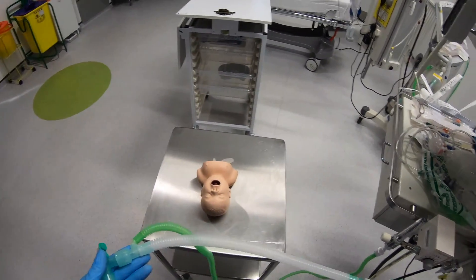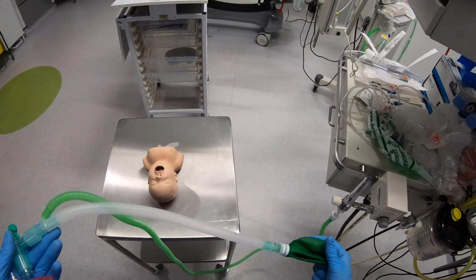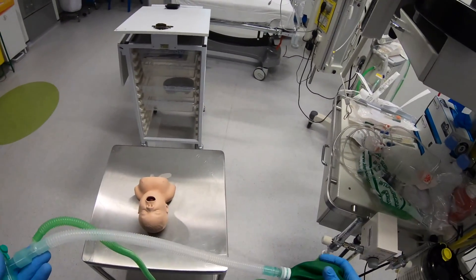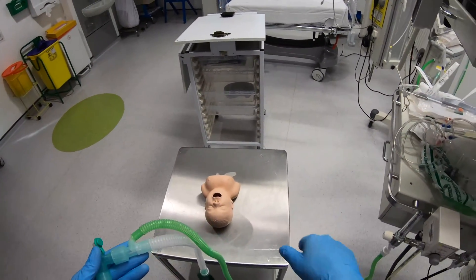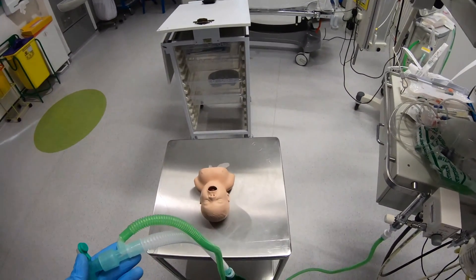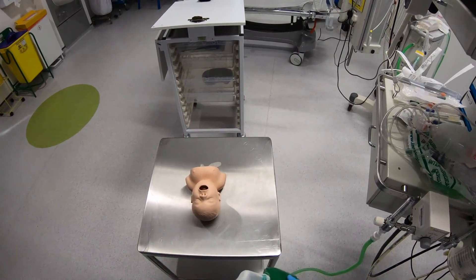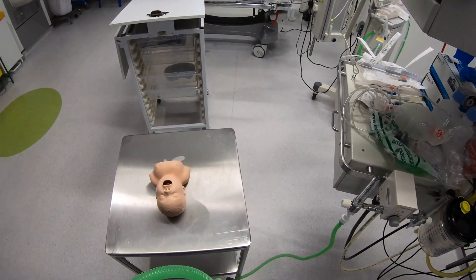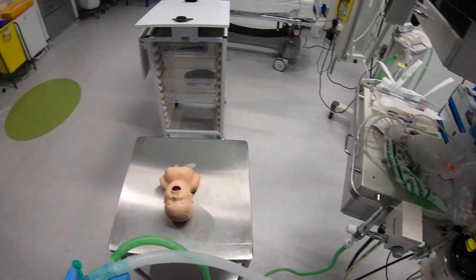Particularly if you're providing positive pressure ventilation, you're going to be giving the gas collected in this reservoir bag back into the patient when you ventilate them. So you need the flow rate high enough that all the expired gas has been washed out through the end of the bag. In general we would use 4 litres as a minimum and you want at least 2 to 3 times the patient's minute volume.